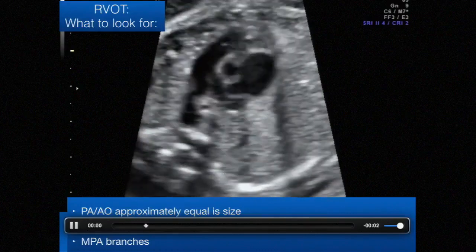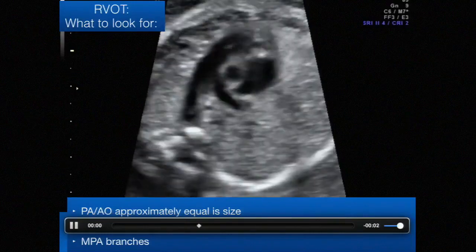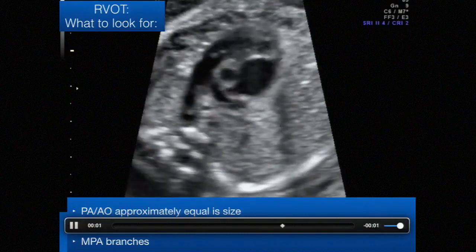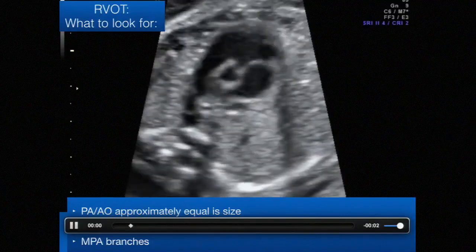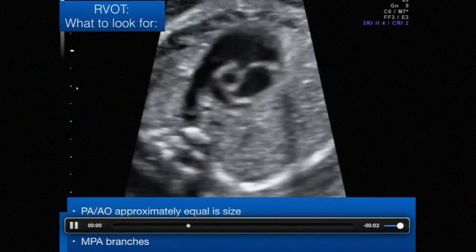So as I'm going through in 2D, I'm really making an assessment of what I think is normal or not normal, and then when I put the color on, it's really just confirming what I already figured out in 2D. So then if I see something unusual with the color, I think I must have missed something in 2D, but I don't. I'm very meticulous about looking in 2D first and then using the color as a supplement.